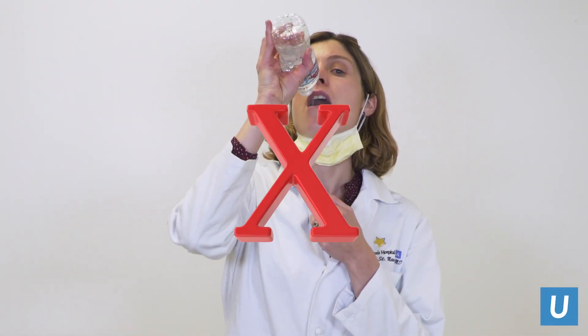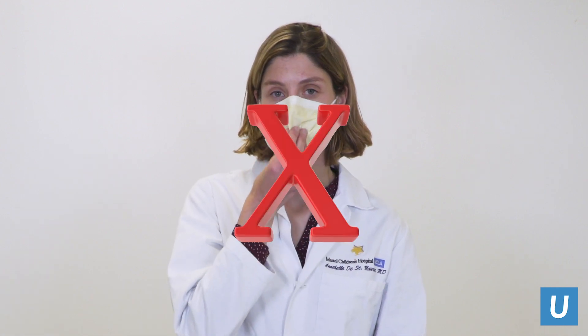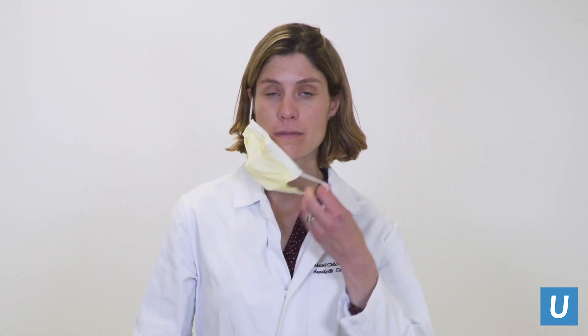Your mask should be removed and stored properly before eating or drinking. If you need to remove your mask, do not do the following: don't touch the front of the mask, don't pull your mask down to your chin, don't hang the mask from one ear, and don't push the mask up to your forehead.